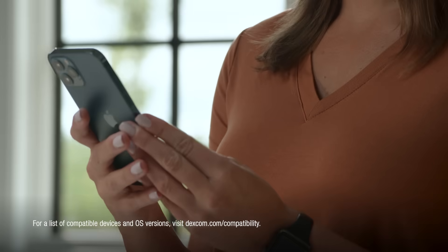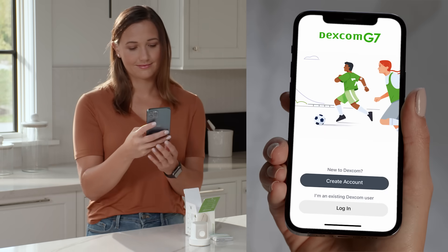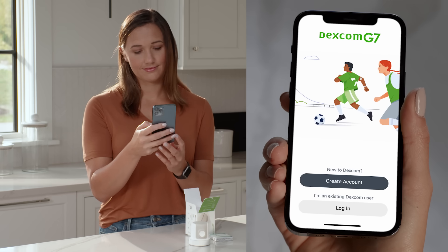The first thing you need to do is download the Dexcom G7 app. You will need to create a Dexcom account or log in with your existing Dexcom account. Once logged in, the app walks you through the setup process step by step.